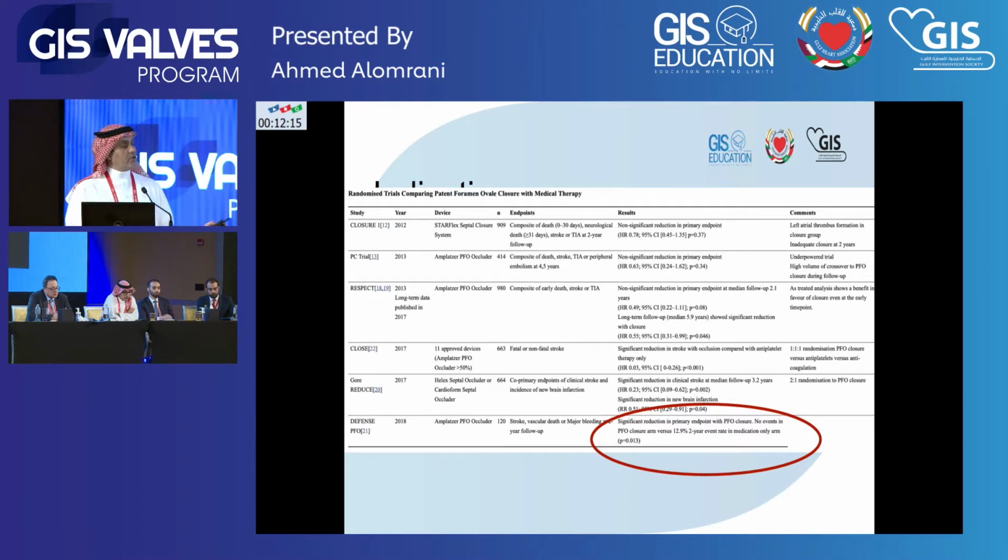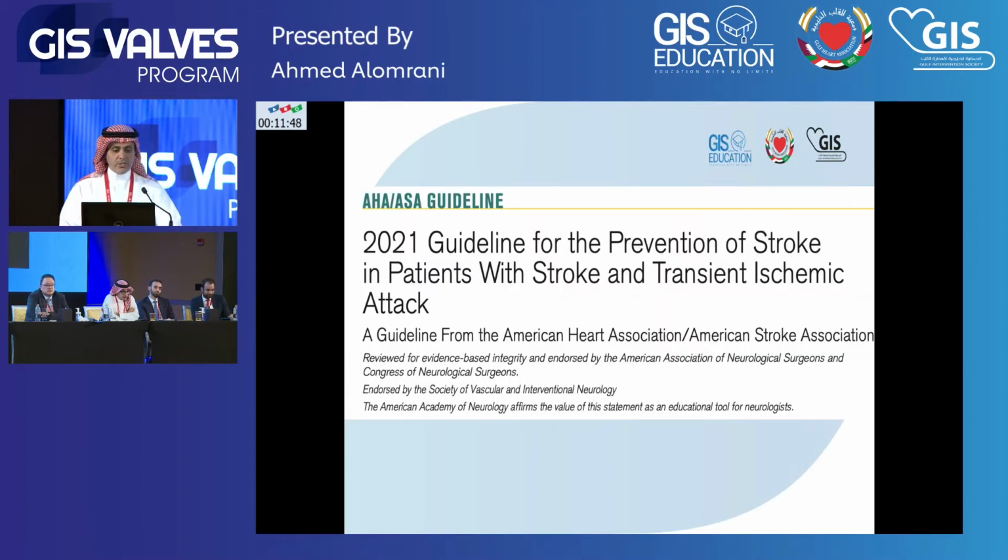If you look historically at PFO closure from the interventional perspective, from 2012 until now, it went through a waveform from aggressively closing all PFOs, weaning down to basically not really being favorable of doing it, until recently, with updates from the old studies, pushing for a more selective approach and more insight regarding when and how to close this defect.